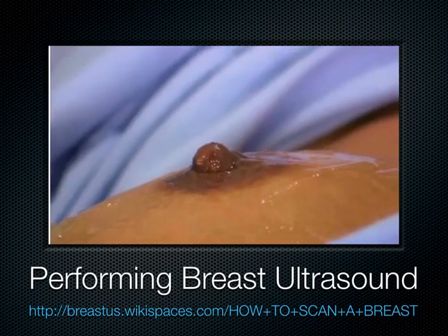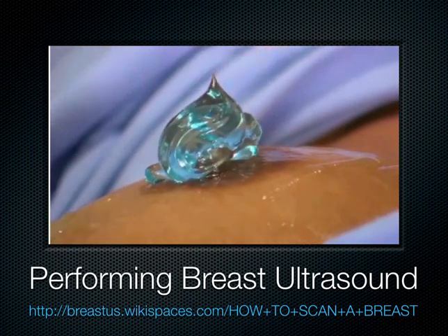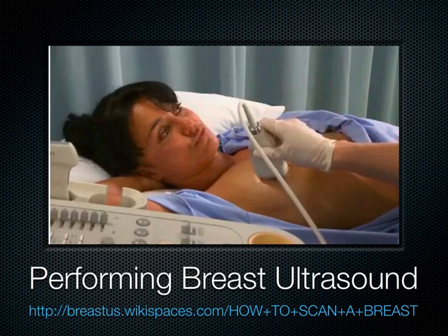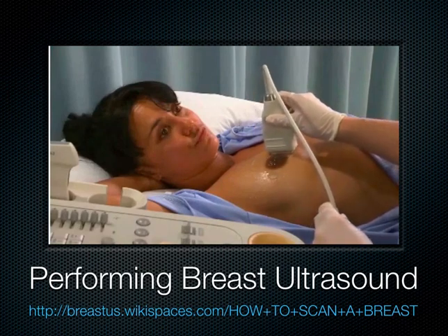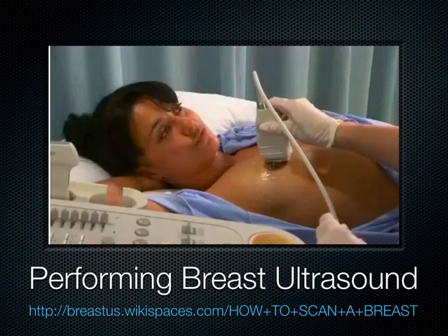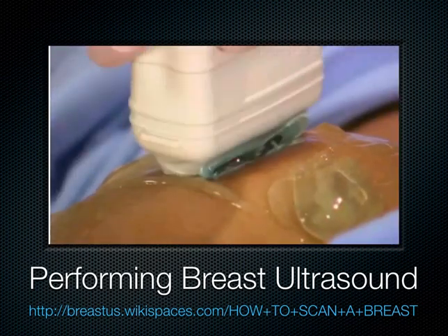To scan the nipple and areola, place a generous amount of acoustic gel directly onto the nipple. Place the transducer to the right of the areola in the longitudinal plane. Scan the area from the right of the areola, over the nipple, and just beyond the left of the areola. If any pathology is encountered, measure the length, height, and width of the lesion.